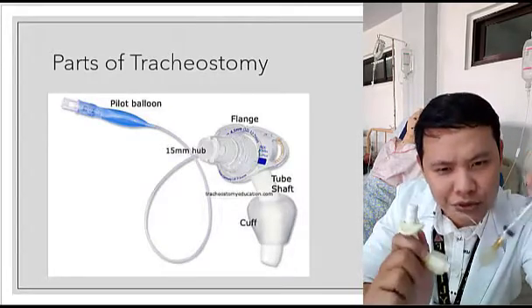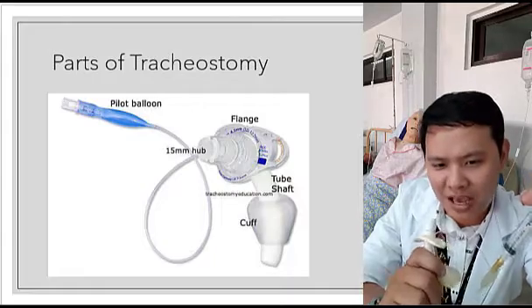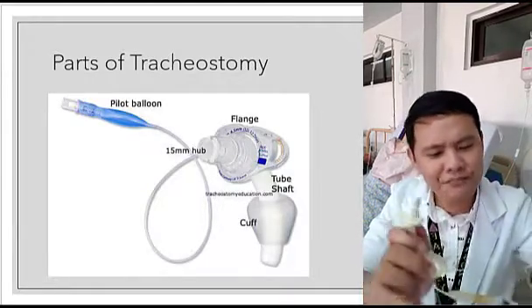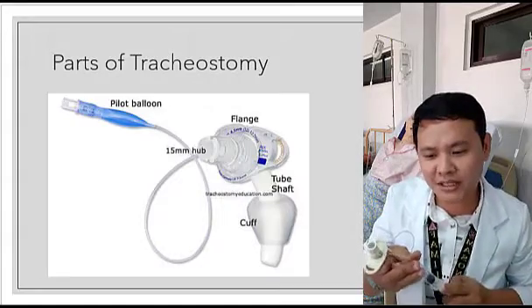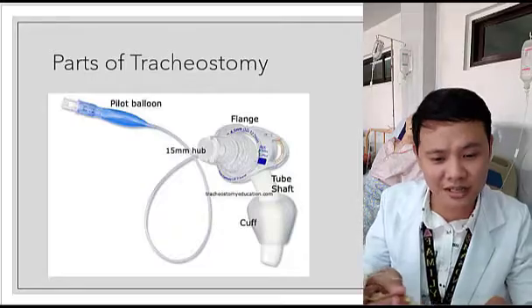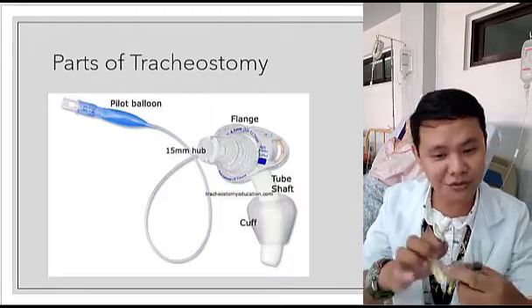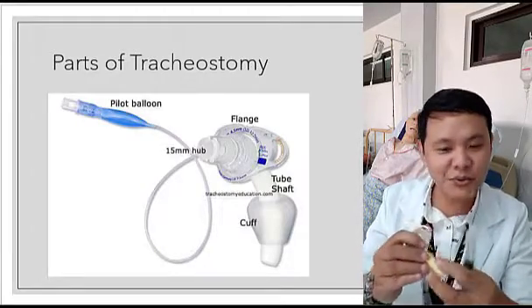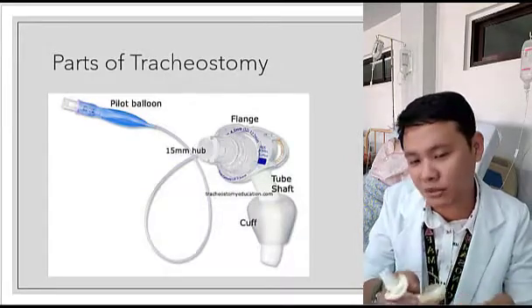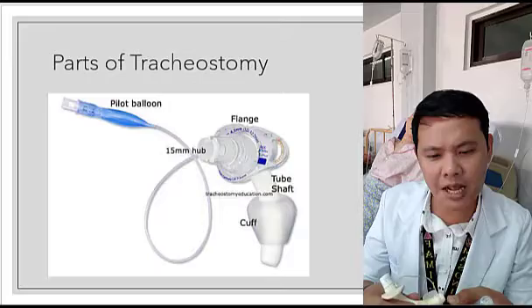Pero huwag kayong mako-confuse because there are some tracheostomy na ang ginagamit po nila is water. Okay? There are some tracheostomy na gawin na makikita ninyo. So far, wala pa ako nakikita rito, but in some other countries, they are using the water valve po. Okay? Yung cuff, tubig po yung nilalagay. Okay? Pero very secured po yun na hindi siya mabubutas. Okay? Silicone material ata ang ginamit nila ron.